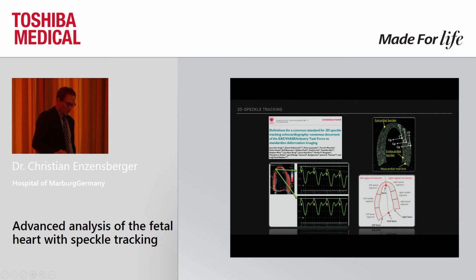I said this is a new technique. There are definitely some things which need to be changed during the next months, years. One very important step has already been done. This recent consensus paper by the European and the American Society for Echocardiography put some things together.